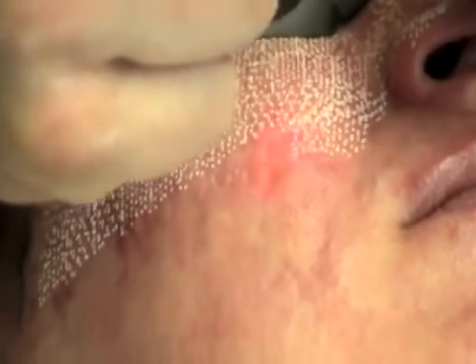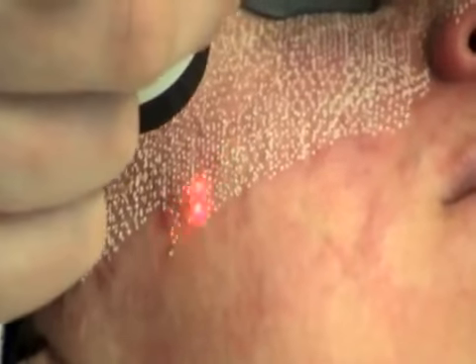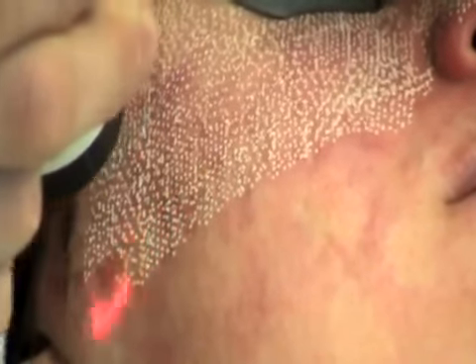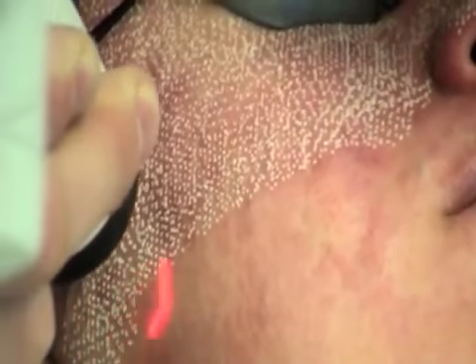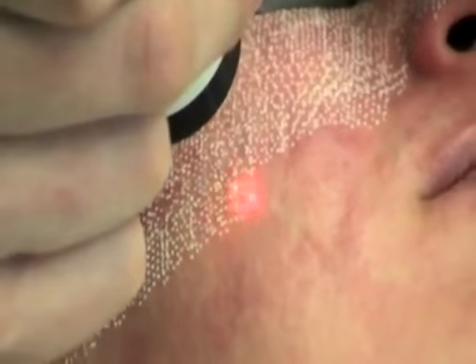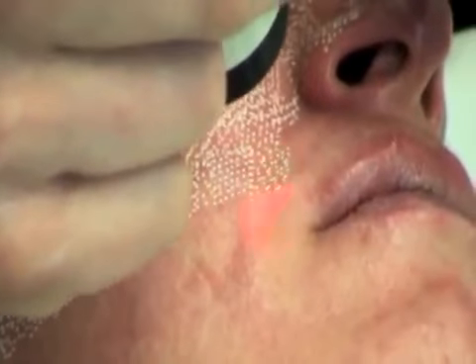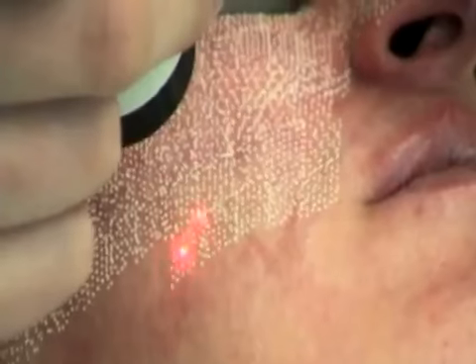Theory is that these spared areas will allow for much faster and safer reepithelialization. The downtime following a fractionated ablative device procedure is dramatically less than the traditional ablative procedures. Unfortunately, since only a small portion of the skin is treated at each treatment, multiple treatment sessions are required to get the optimal effect. However, even after a single treatment with one of these devices, dramatic tightening and improvement of acne scars can be seen.